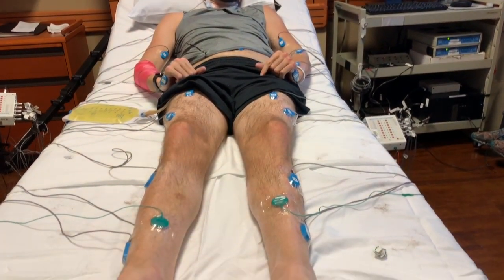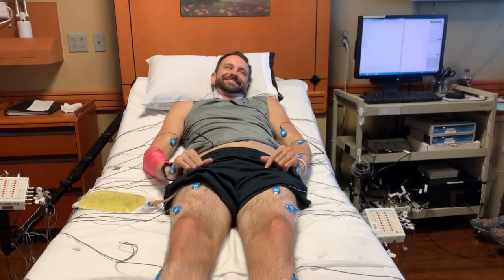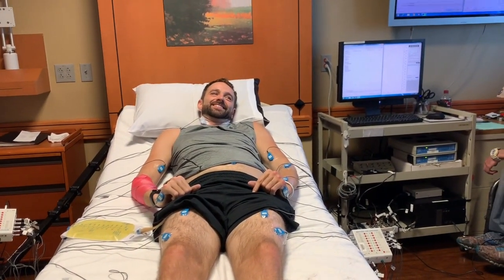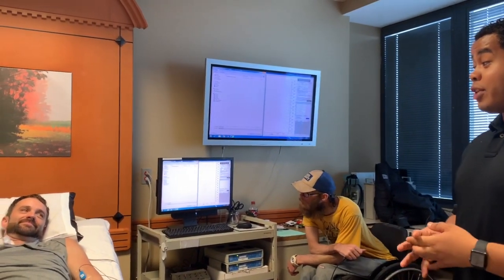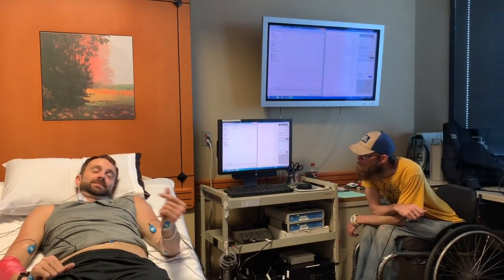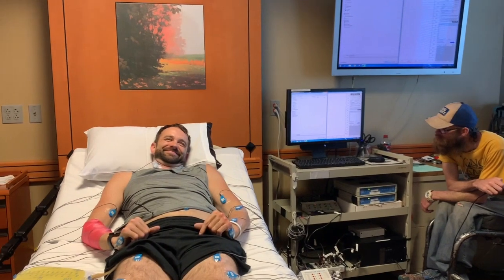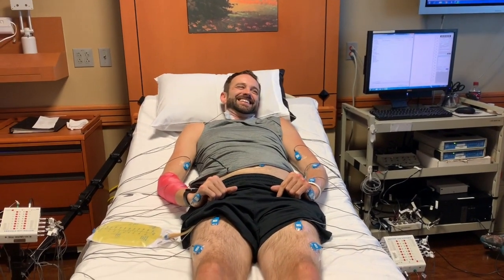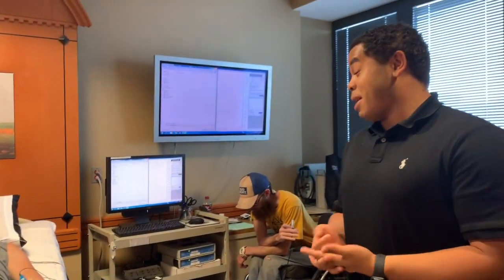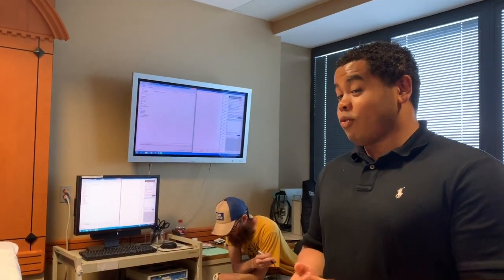Each task we're going to perform three times. Before each attempt, Dana's going to say 'ready.' You don't have to answer that unless you're not ready for whatever reason — it's just a cue that the event's about to start. You'll hear a beeping tone that's going to last for about three seconds. During that time you'll be performing the event, and once the beeping stops, you'll relax. I'm going to be reminding you to relax — I'm not picking on you — we just want a clean picture of your muscle activity before each attempt.